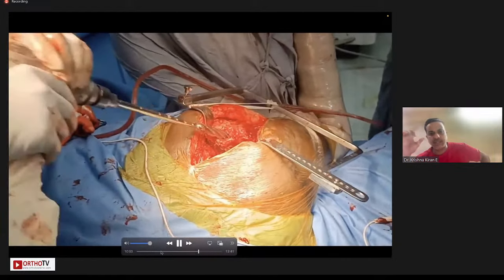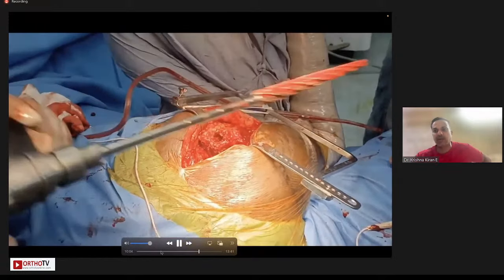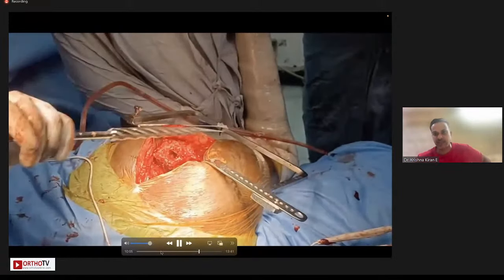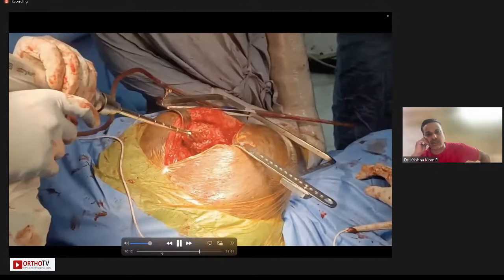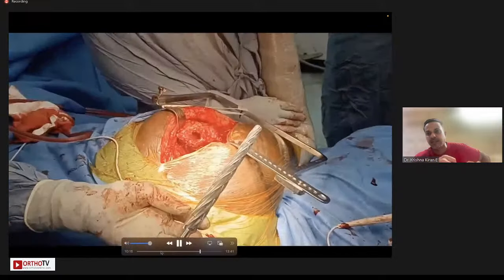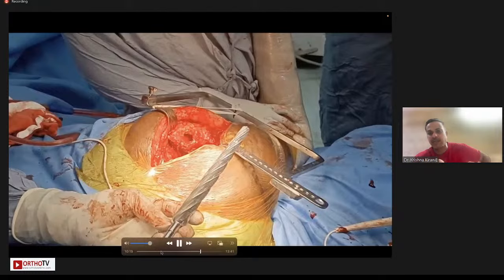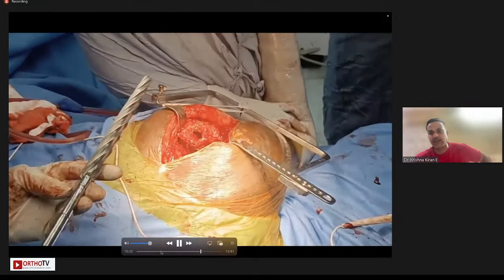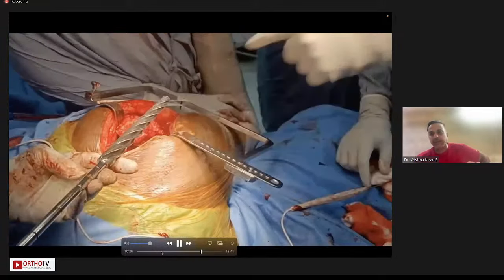You identify the reduction point for the particular patient and then keep on upsizing till you cannot engage the reamer further in. So this particular system, Monomod, has got a shoulder reference mark, which you can mark as the reduction point on the greater trochanter, and then optimize that particular reduction point by keeping on upsizing the implant so that it will be ideally sized and it will not subside over a period of time.